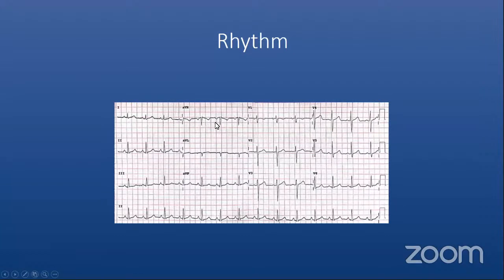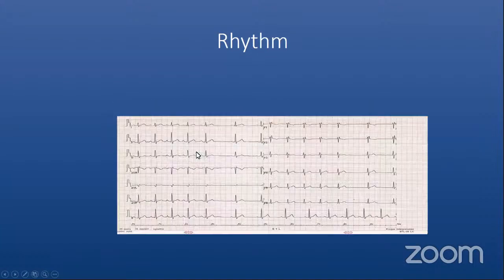So looking at the RR interval again, this is regular. Looking then at the P wave, yes, there is a P wave, and if the P wave axis is normal, that rhythm is going to be normal sinus rhythm. Then looking at this ECG, is the RR interval regular? No, it's not regular. So that means the rhythm is not regular. It's basically an arrhythmia. So normal rhythm is sinus rhythm. So this is the arrhythmia, basically.